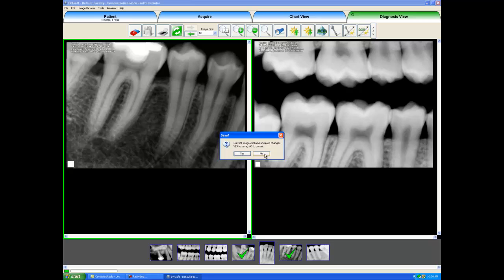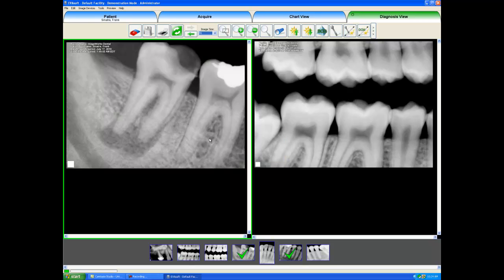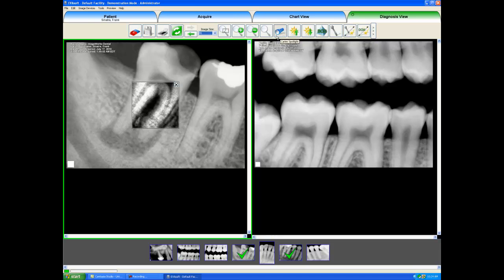Now the best tool that we have in Evasoft, in my estimation, is the caries spotlight. What the caries spotlight does is it makes darks darker and lights lighter, so something that would naturally show up as darker on an x-ray, like an abscess or decay, it will amplify that, making it easier to see. It's a detection tool.